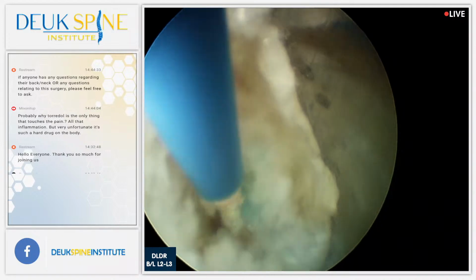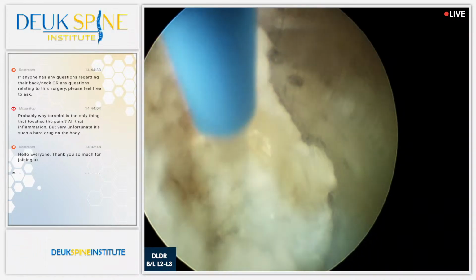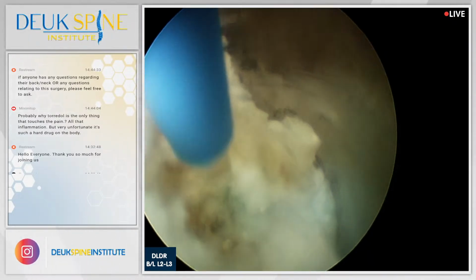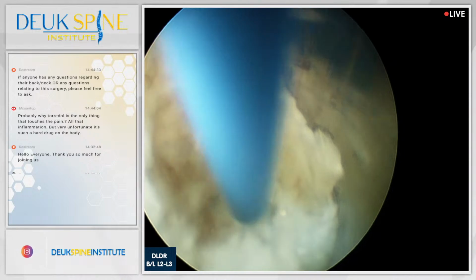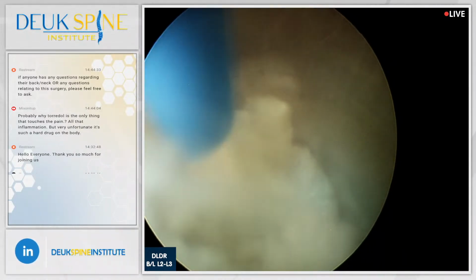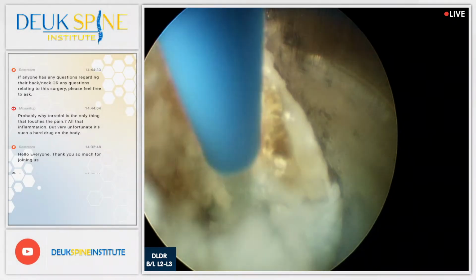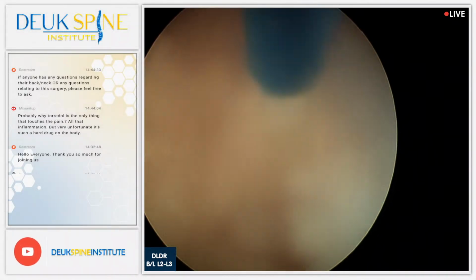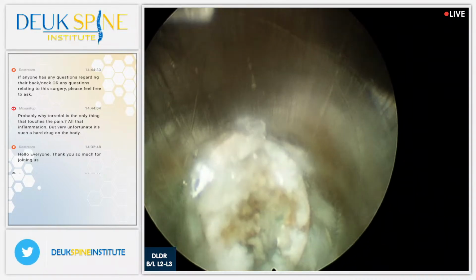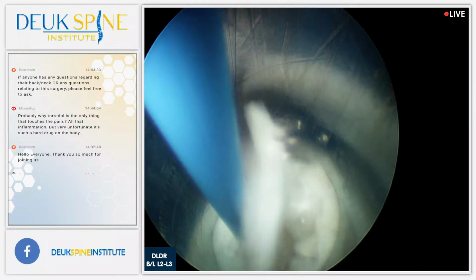That would be like walking into a house through the front door and expecting to see 100% of the house through that front door. You just can't. There's rooms, there's walls, there's doors, there's corridors, and you have to move around to be able to see more of the house. But some houses, like a flat, you could see everything, but we don't have such a situation here in the spine surgery world. There's no way to see 100% of the disc through any approach.